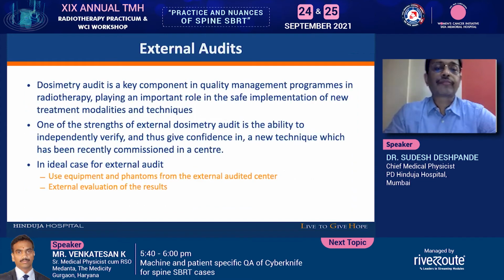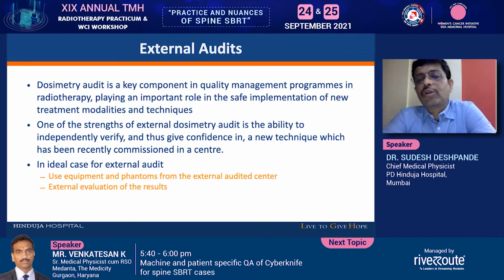Okay, now we'll talk about something about the external audits. Dosimetry audit is a key component in the quality management program in radiotherapy, playing an important role in the safe implementation of new treatment modalities and techniques. One of the strengths of the external dosimetry audit is the ability to independently verify and thus give confidence in the new technique which has recently been commissioned in the center.